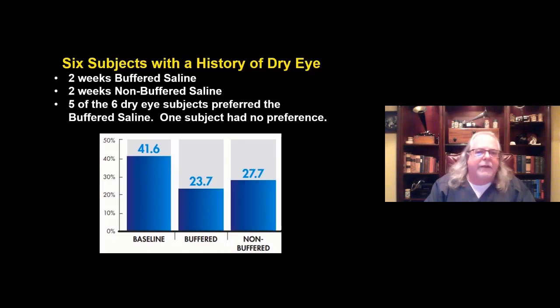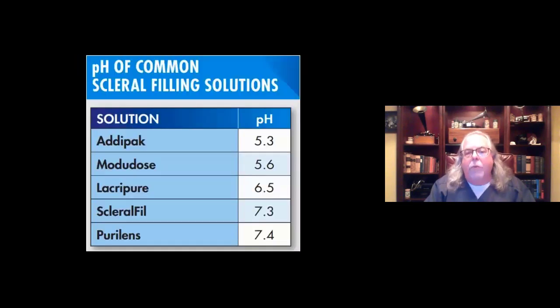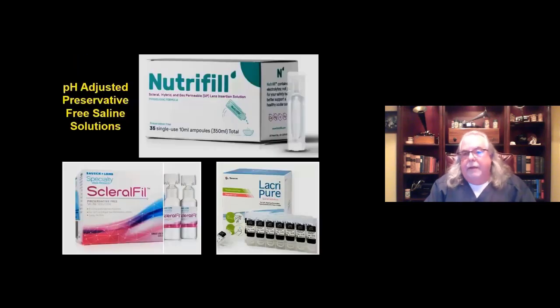So this was pretty insightful to me, that patients with ocular surface disease, dry eyes, post-LASIK, may be better served with one of our more modern preservative-free buffered saline solutions.